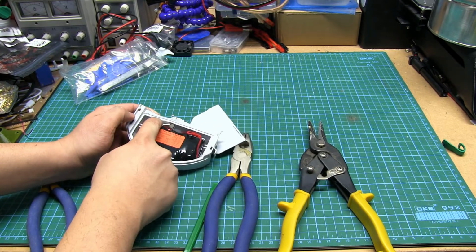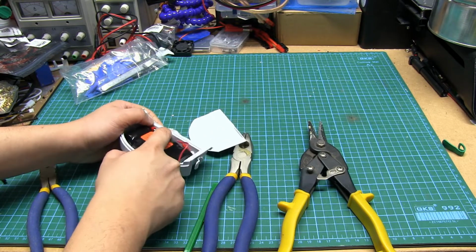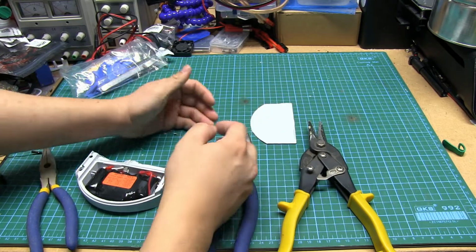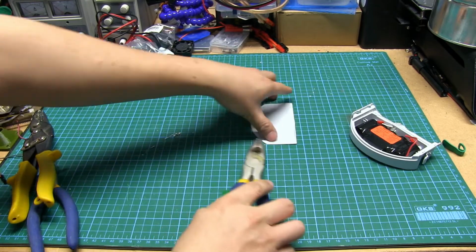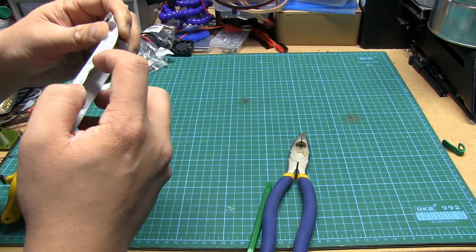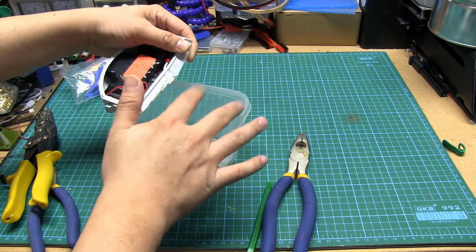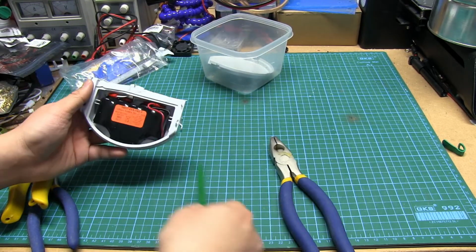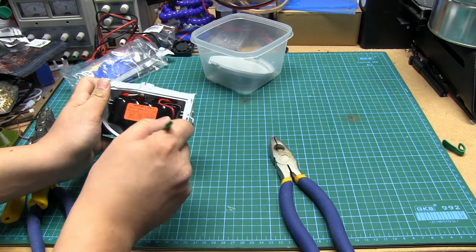We've got two wires here on screw terminals to these gold terminals for the pad pack itself. And actually, I'm going to clean some of this debris up first. Also, just taking a second to appreciate that the wires are super fine. I'm getting debris of lots of fine little strands of wire. Either way, let's spudger this battery out.